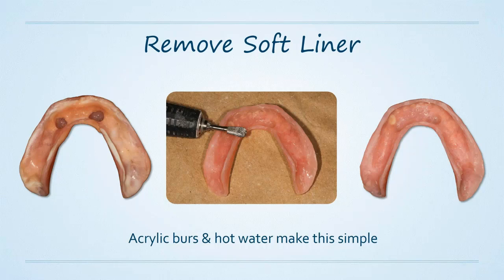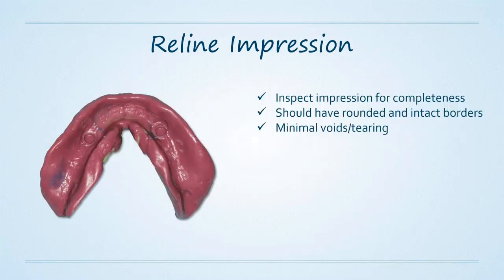So I take my patient's shelled out denture. There is adhesive on that shelled out denture. And then I can do border molding if I need to with heavy body PVS, with green stick compound, isofunctional, you name it, I've tried it. What I'm going to do is a closed mouth reline impression with border molding. My preference in my practice is to use a regular body PVS with some heavy body PVS border molding.